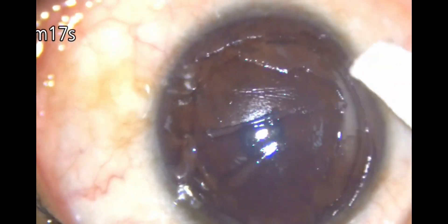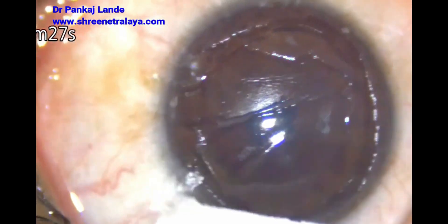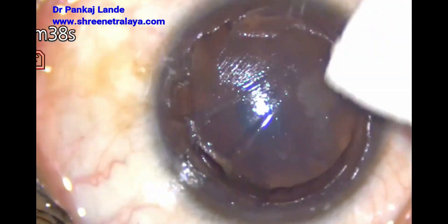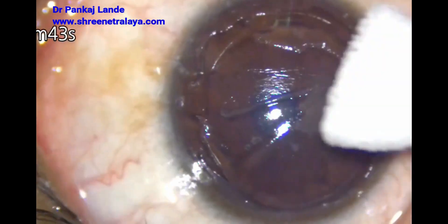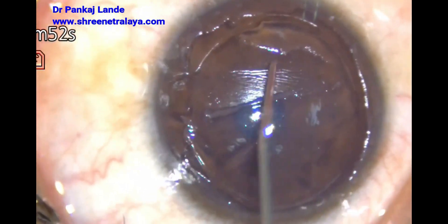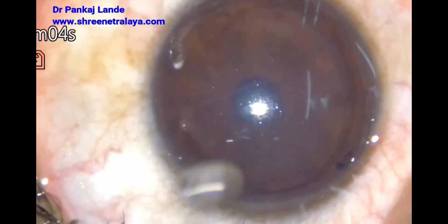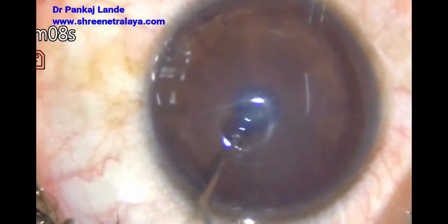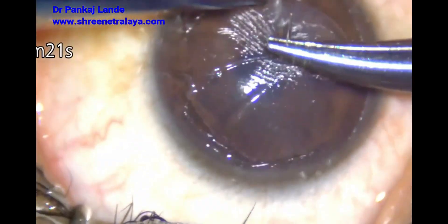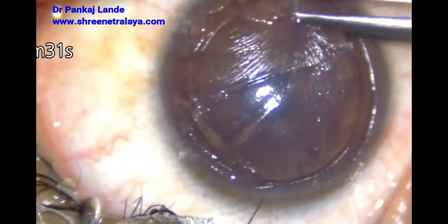Once all this is done, at least three sutures have to be applied — one on the temporal side opposite to the hinge to make the flap tight, and two more on the infero-temporal areas — so that the flap will remain stretched and have a regular smooth bed. I could achieve good results in all three cases.